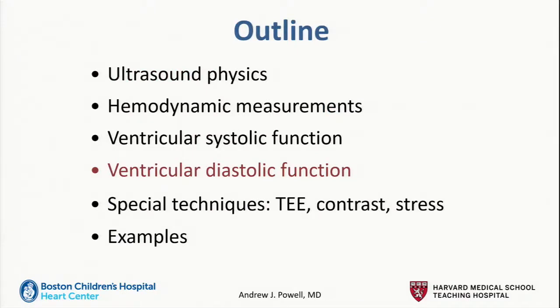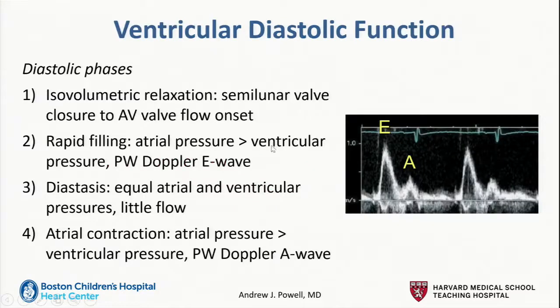So again, we'll begin with some background just to make sure everybody's on the same page, and then I'll come with a way of summing it up and how to interpret diastolic function. So let's talk about diastole. One perspective on this is to divide diastole up into 4 different phases as you move across diastole in time.